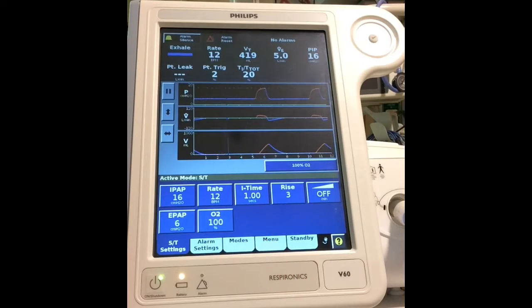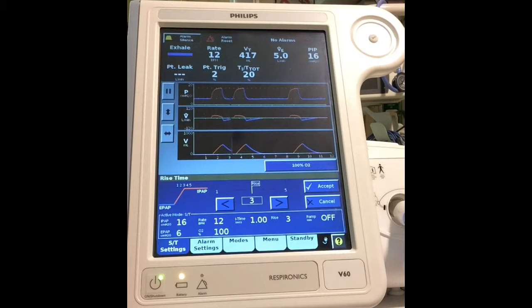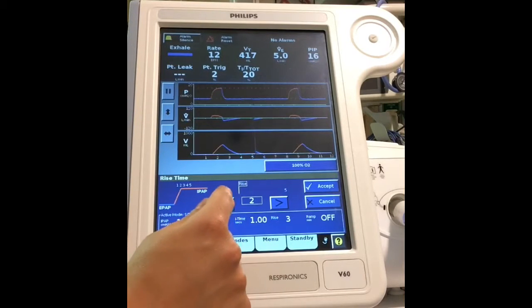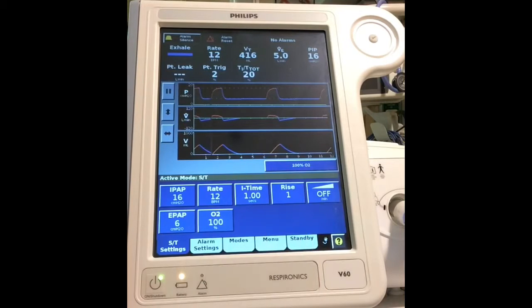Let's say you have a patient that's very anxious on the BiPAP and they're just not comfortable. They're feeling like they can't breathe despite having the appropriate tidal volume. So what I do then is I will change my rise. This is going to deliver a fast breath. If I go to 1, you can see on this little figure right here, it's a really sharp incline, which signifies a very fast breath. I'm going to hit accept, and it's going to deliver a fast breath.